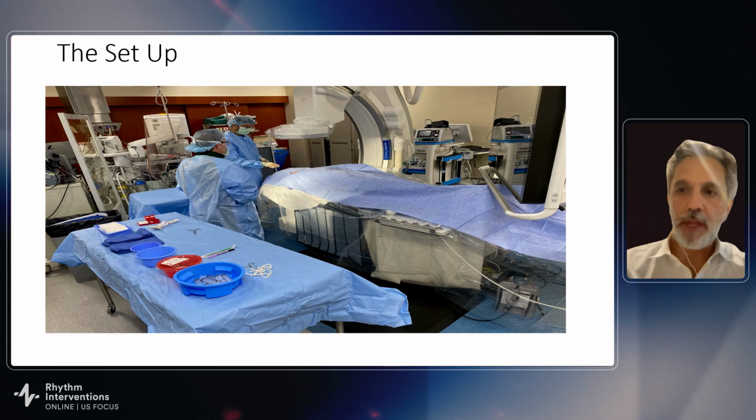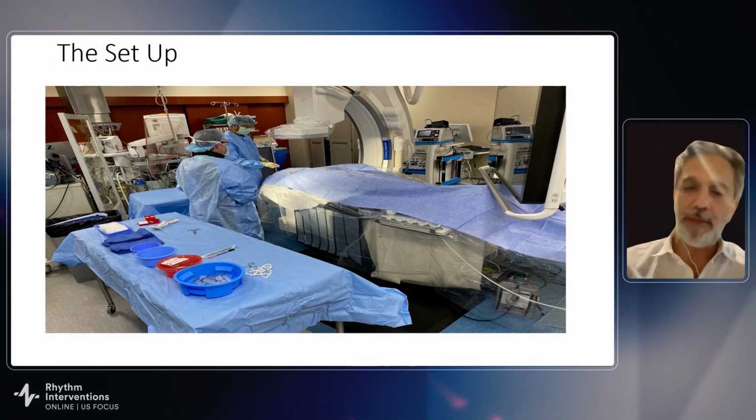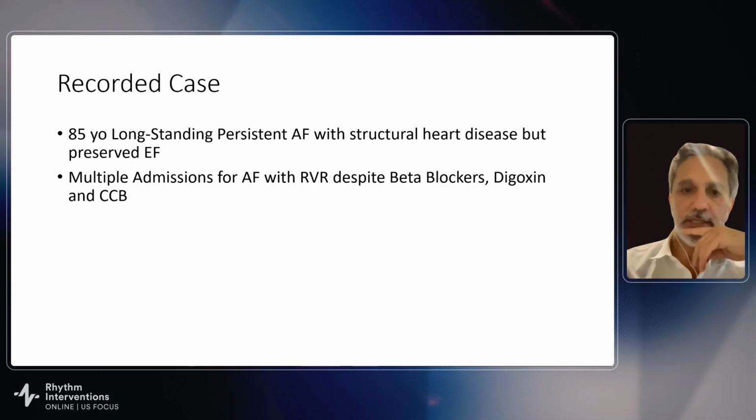Now, the case I will show you, we didn't do this. The case that I show you was maybe the third or fourth case that we've done IJ early on in our experience. And now we'll show you a recorded case.